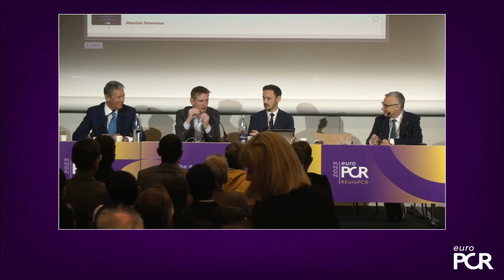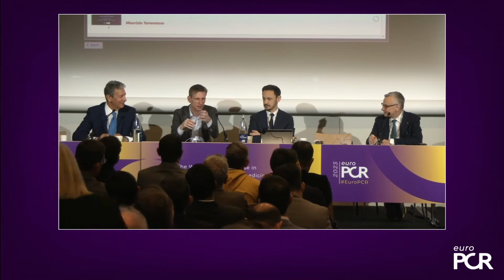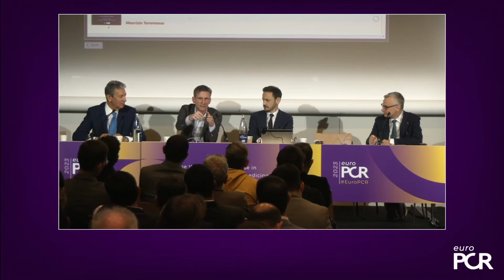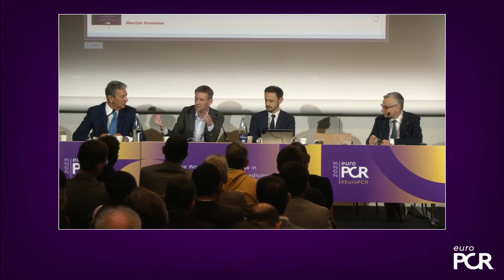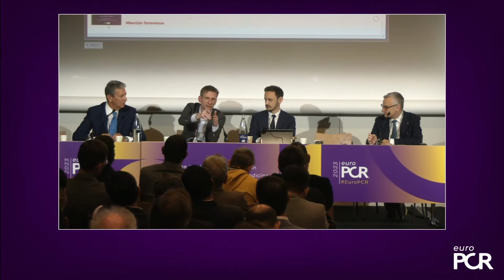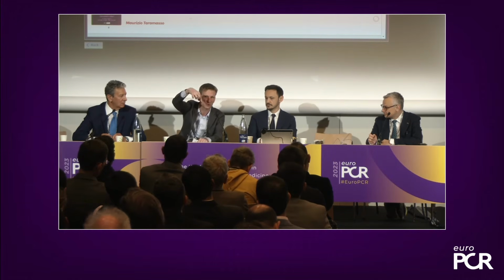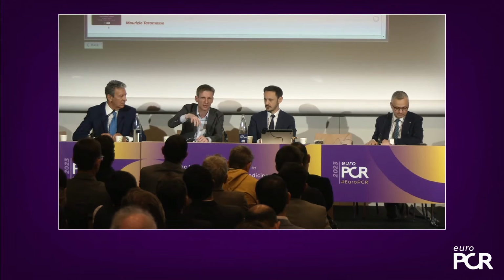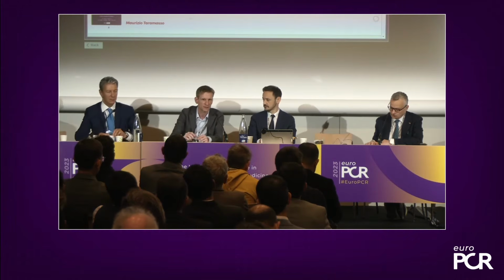I see it in fellows when they start doing their first echo-guided punctures. Because they want to see the tip of the needle immediately, they start their puncture too close to the echo probe, and then to correct they go very vertical, and they end up with a final puncture with a needle at almost 80 degrees. That's not a good recipe. Then you also get a kink or an S in your wire. So that's why I think Sergio's rule is correct.